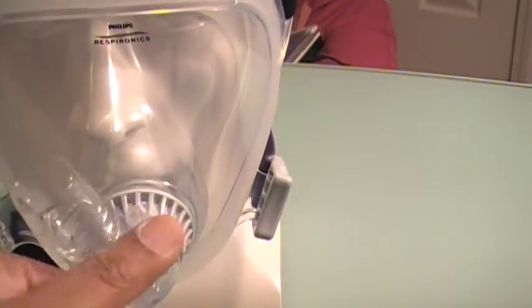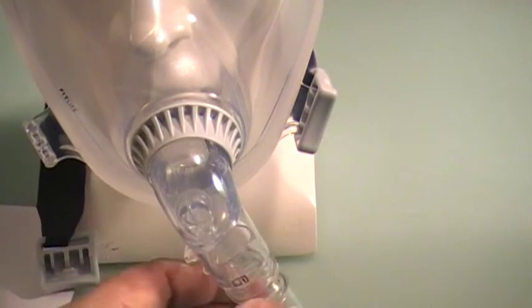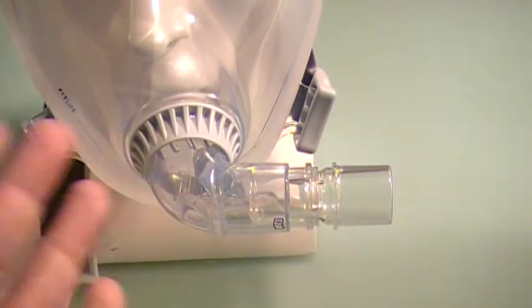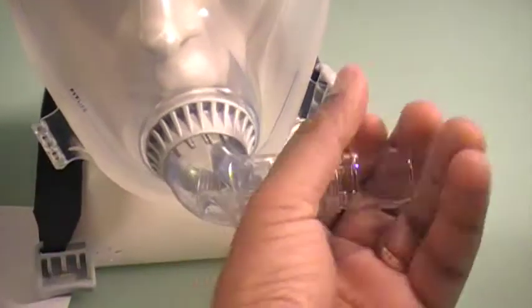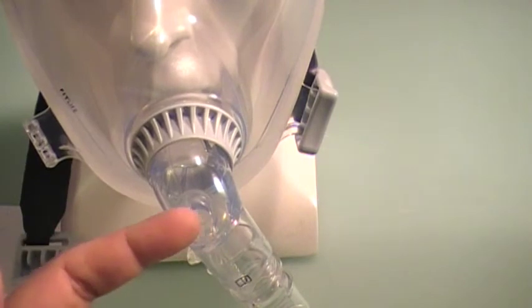The elbow rotates 360 degrees, which is a very good feature. This way you can move the tubing out of your way so you're not being tangled up in it when you move from left to right. It also helps reduce episodes of leak, because depending on where your tubing is, it can pull the mask slightly off your face.